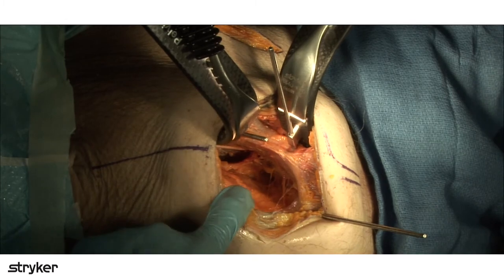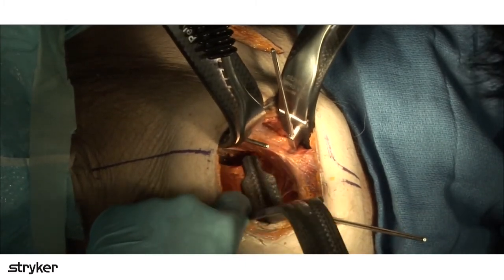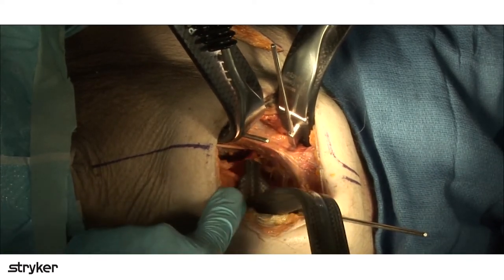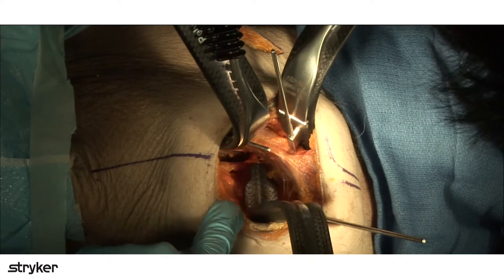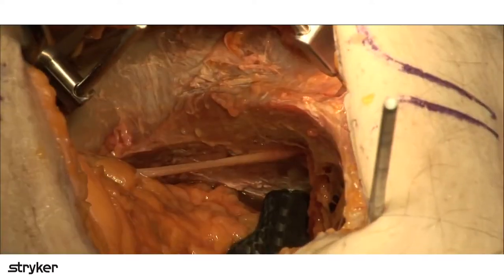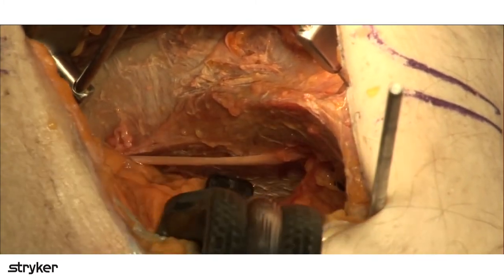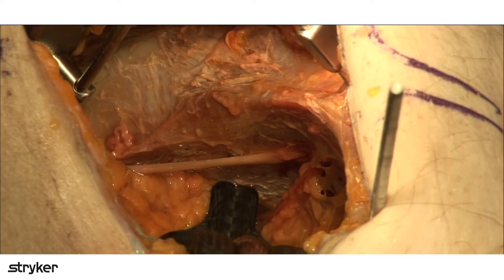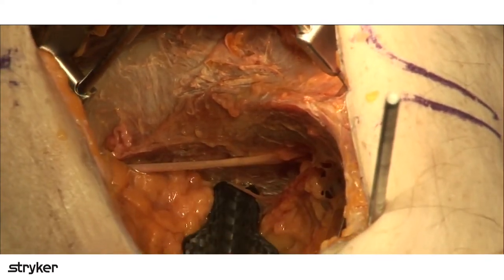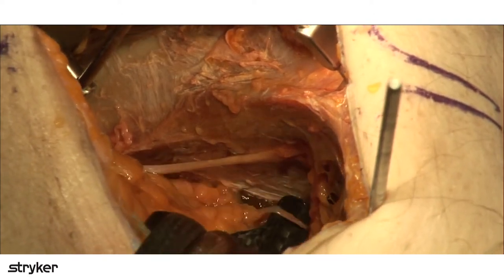Except for the, yeah, right. Sorry, I forgot. Hang on, Mike. So this is the suction retractor that's kind of nice to use. The one thing about doing this exposure is that fluids, especially blood, tend to pool in the base of the wound as you're doing this. And so this retractor is nice because it does two things for you. Because of its shape, when you put it in, it pushes the bladder away and really opens up the exposure of the posterior column for you, as well as the quadrilateral surface.